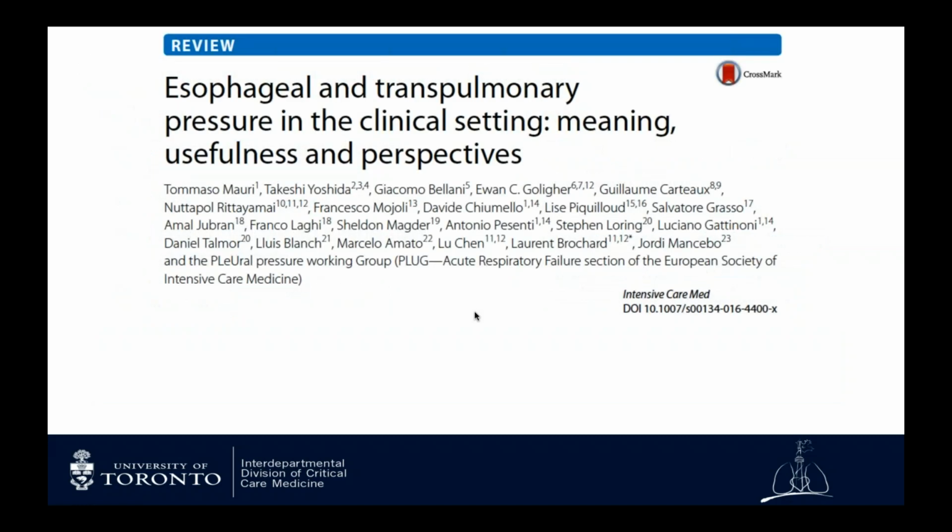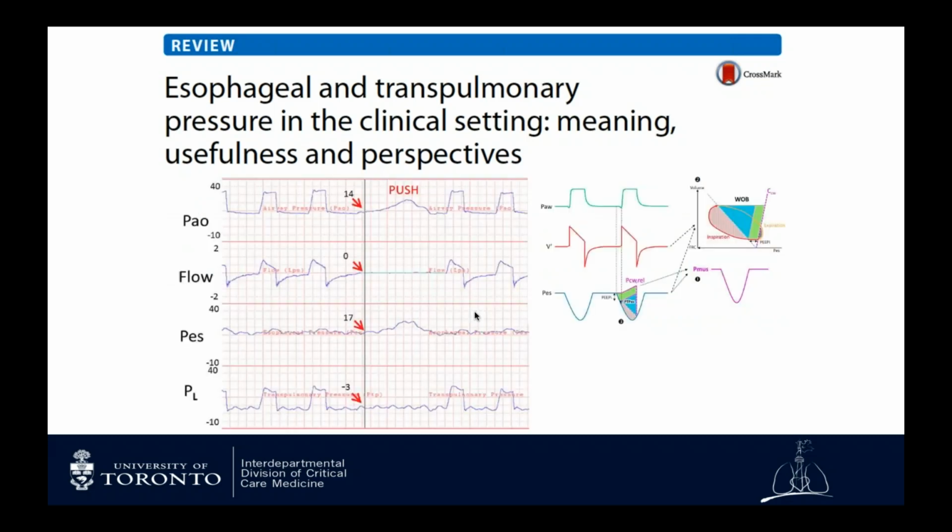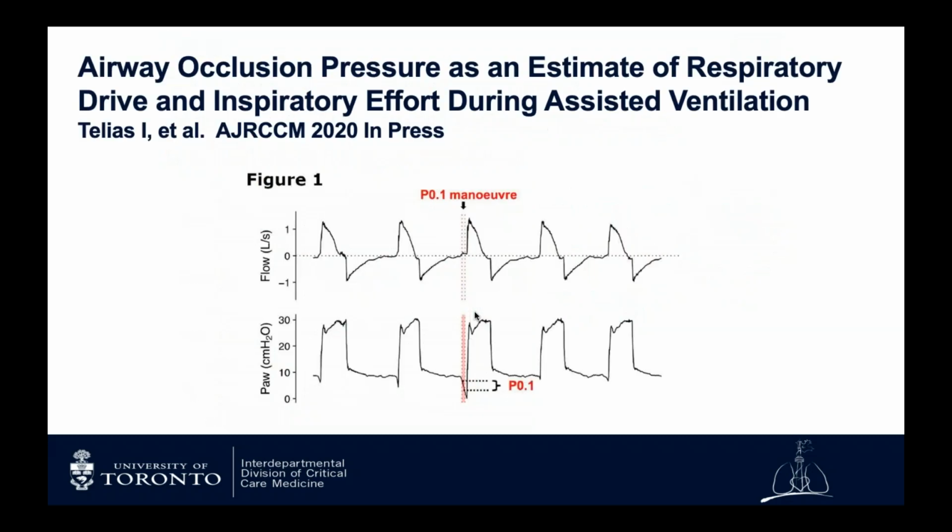So if we're talking about the size of effort, that means we have to figure out how to measure that. And I'll just remind you that the gold standard for measuring effort would be the pressure time product across the diaphragm that we would measure with an esophageal balloon. That's possible to do, and we do put balloons in not infrequently in our unit. But even simpler is that you can estimate effort with a couple of non-invasive maneuvers.